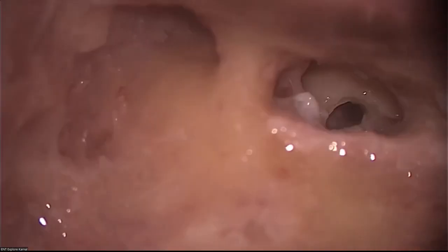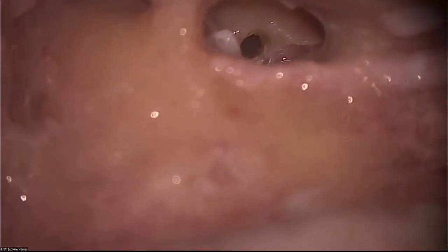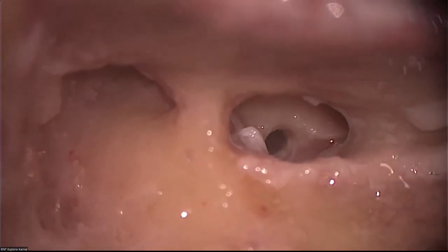Yes, we can see. We can see the part of the basal turn of the cochlea in the scala. Medially, if I turn, we can see inside, medially is the modiolus. And if I turn this way, this is the straight lumen in the scala tympani. Can you see very clearly? Yes, very clear. So we want the implant to go straight in the lumen. For that, all you need to do is widen the round window inferiorly. That's it. Nothing else is required, and we have a straight shot to insert the implant straight into the lumen.